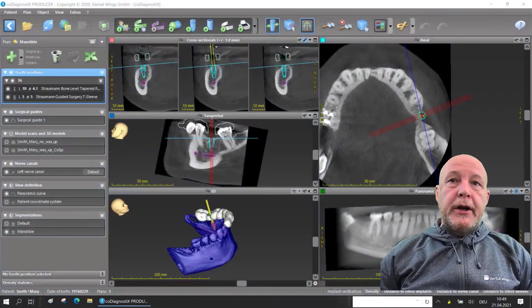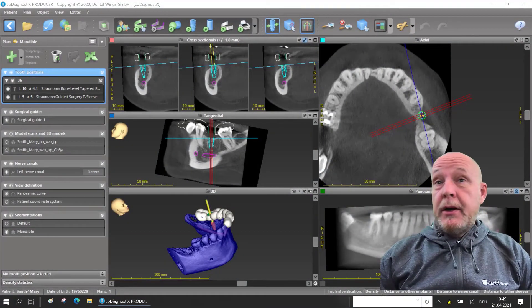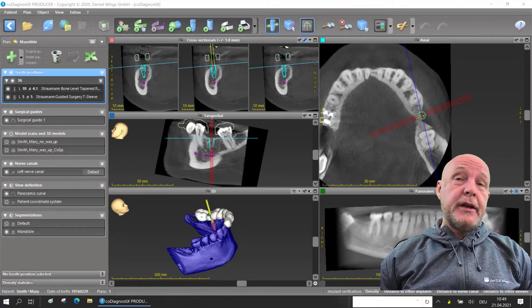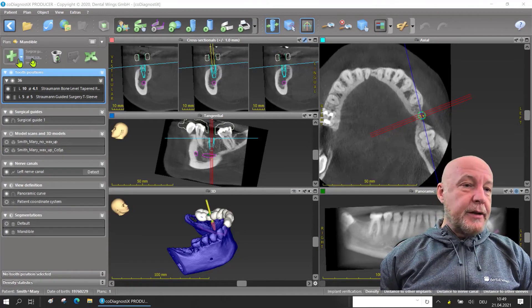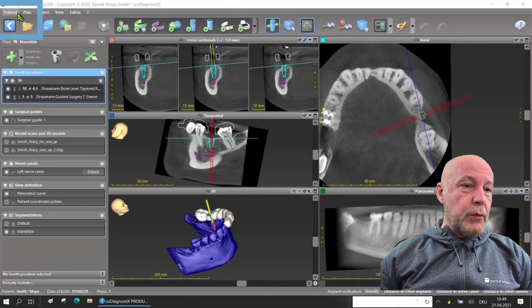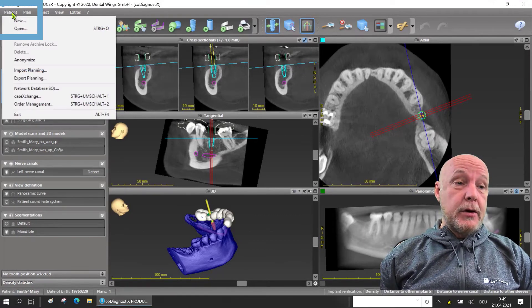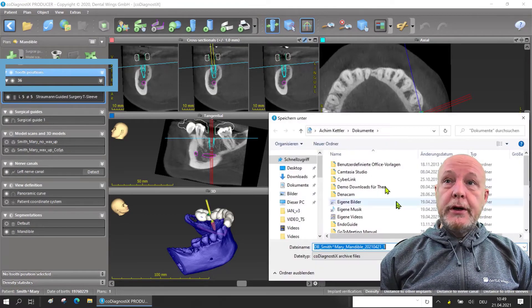If you're already with your planning and want to export it — maybe on a USB stick or send it to a colleague without case exchange — there is a nice feature. We can export just this single plan: go to Patient, then Export Planning, and you can store it.